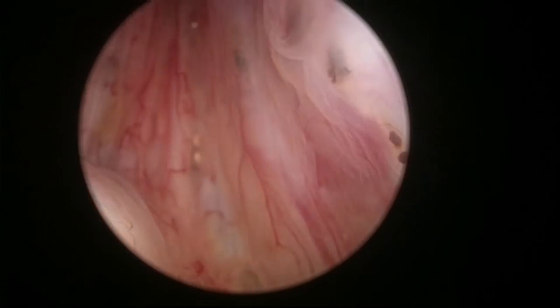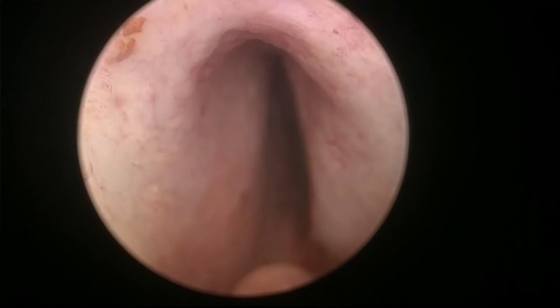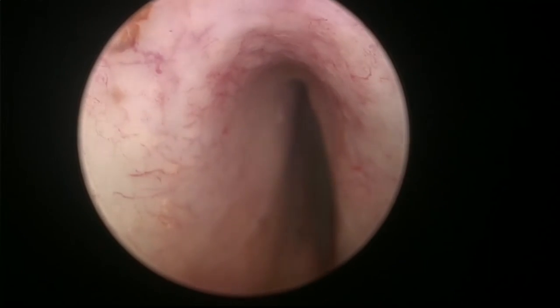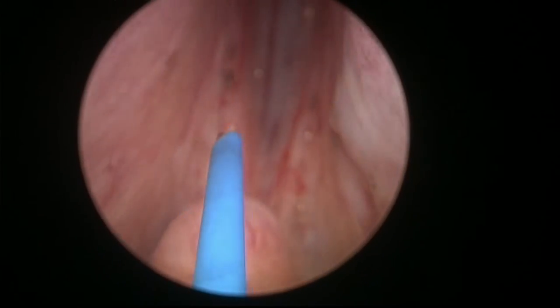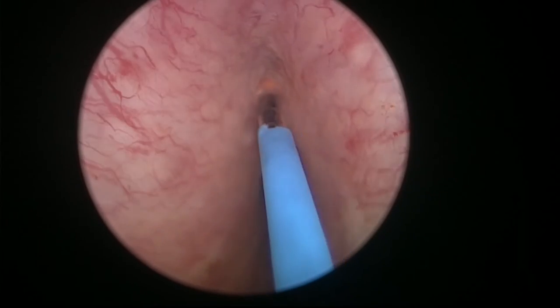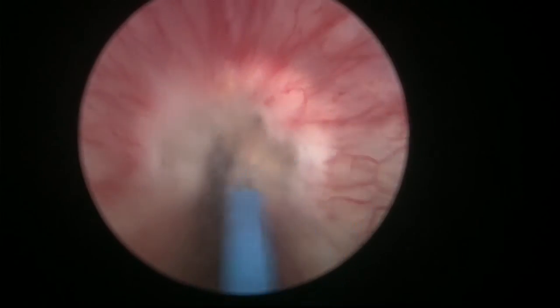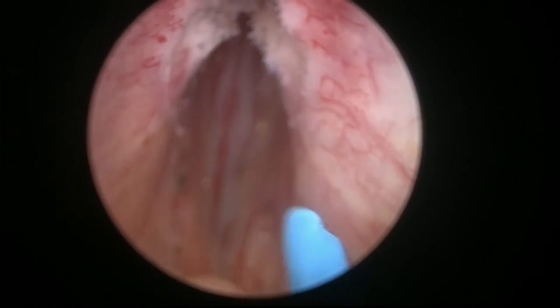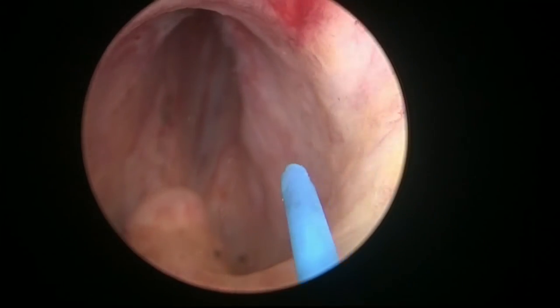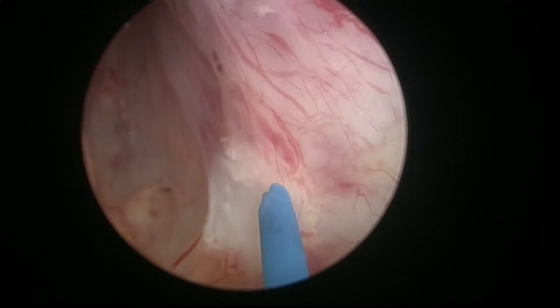You can see the patient has some stones forming submucosally. That's the introduction of the fiber and the contour of the sphincter. You can see the sphincter is clearly visible. That's the 12 o'clock limit. Sometimes if you do the maneuver from the veru and tilt up it shows you a good reference, but not in every case. I would rather trust what I see in terms of the contour of the sphincter, and I like to mark at 12 o'clock initially.